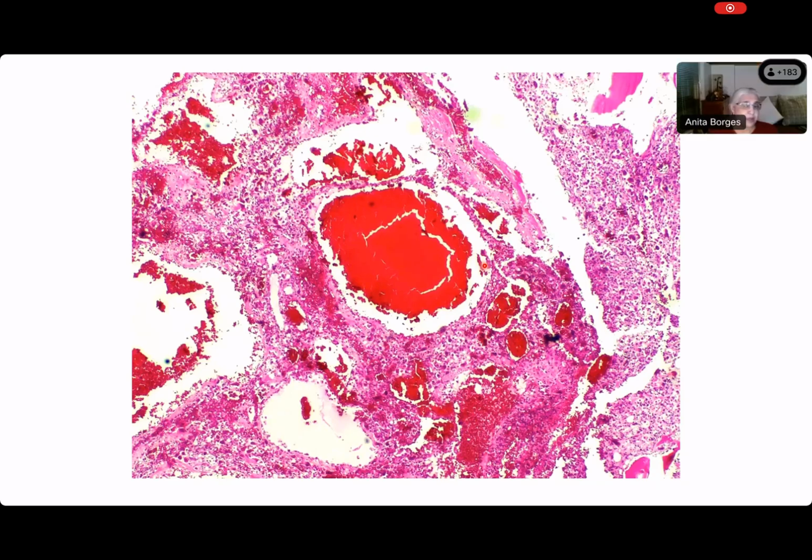Excellent. Because now we have to understand what is hemorrhage, right? Hemorrhage is extravasation outside of a space. Okay, so you can't just call anything hemorrhage. This is so well known in bone tumors. What do we call these spaces in bone tumors? Yes, Prayas? Prayas, what do you call spaces that are full of blood when they occur in bone tumors?